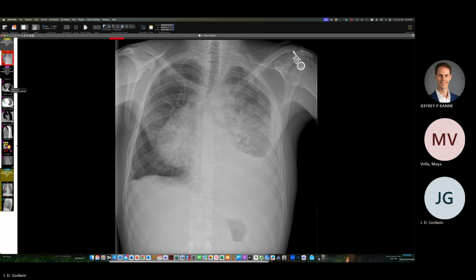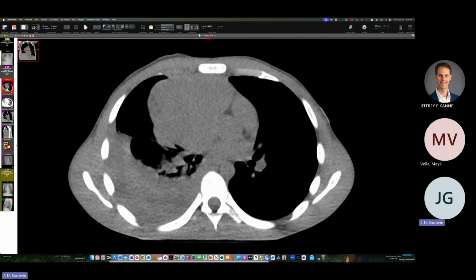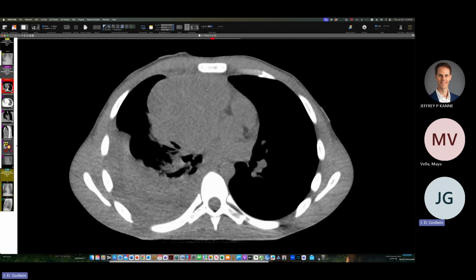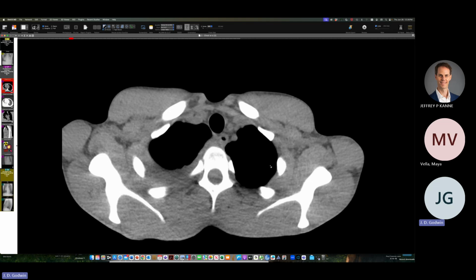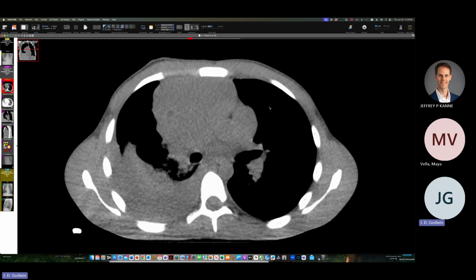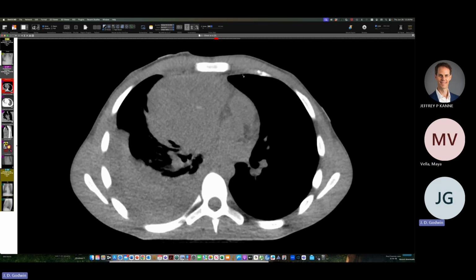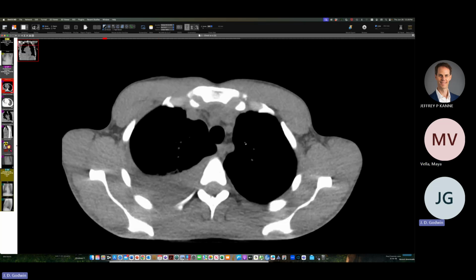And let's scan through this mediastinal mass. So here it is, big thing like this. There was a PET scan, which I can't anonymize easily, and it showed uptake in the rim of this thing, but also uptake in axillary lymph nodes and several pleural locations here on the left. This particular CT scan is earlier than that last imaging, which had all the big left pleural effusion, but there was uptake in pleural nodules around here and pleural nodules over the left apex on the PET.